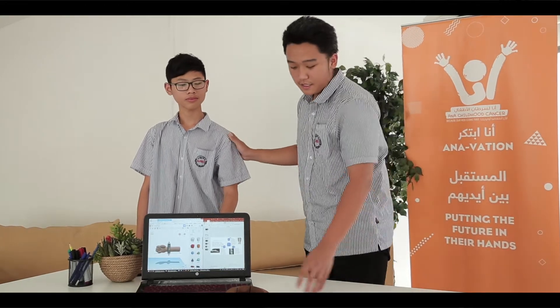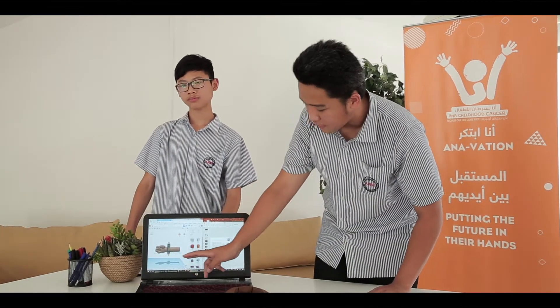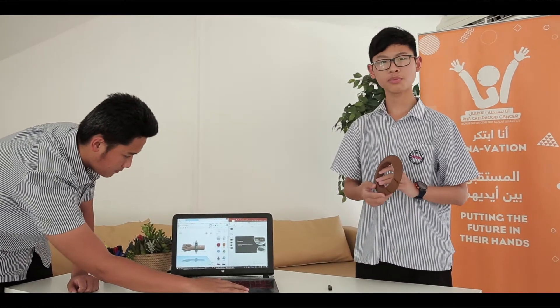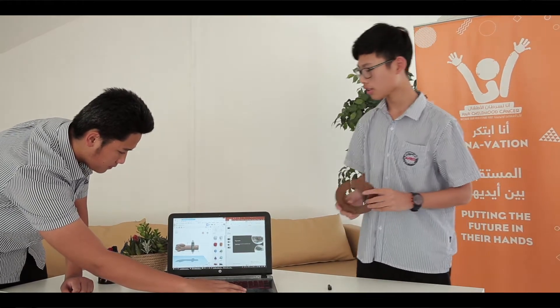My friend will talk about the details of each part of our project, and then I will show how this project works on the website. This is our model. We printed it with a 3D printer and now I am going to show each part and its functions.